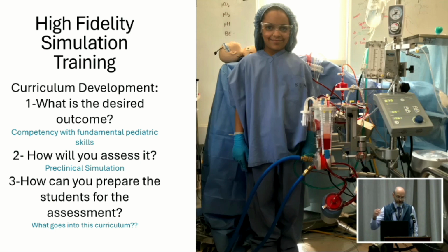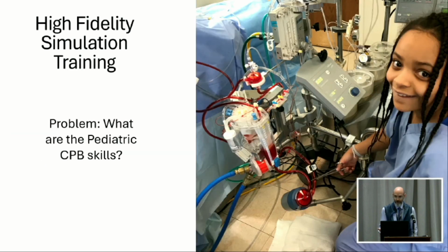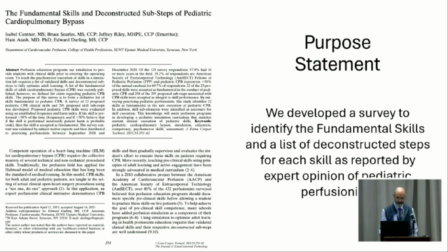So with those in the background, then you say, well, how would I build a curriculum so that I could assess it in this environment and to that standard, which then of course begs the question, what are you trying to teach? And this is what we didn't necessarily know. See, the dialogue is that pediatric perfusion is a specialty, so I couldn't just assume that what we are teaching with our larger circuits and larger reservoirs and bigger pieces of tubing and larger clamps is necessarily, it may fall short. So we did a survey.